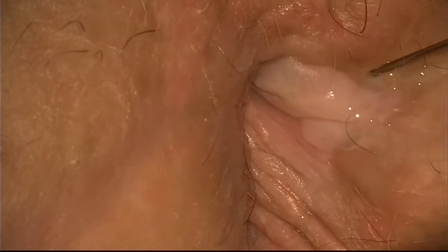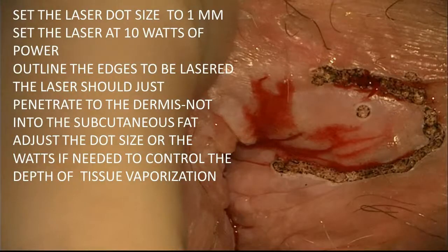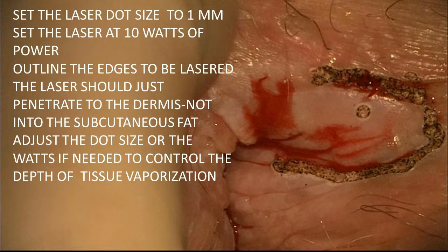I will place lidocaine with epinephrine under the skin to produce a water barrier and to flatten the skin surface. I will set the laser dot to one millimeter and the laser power to 10 watts.